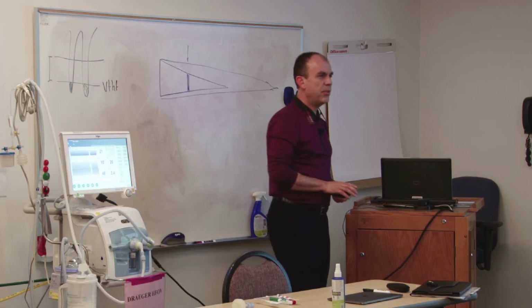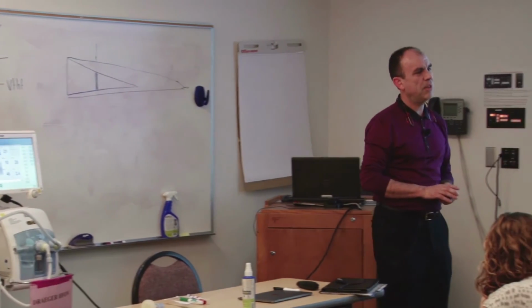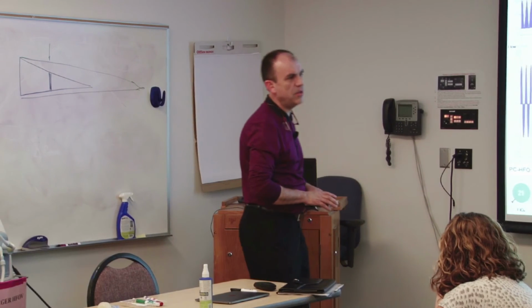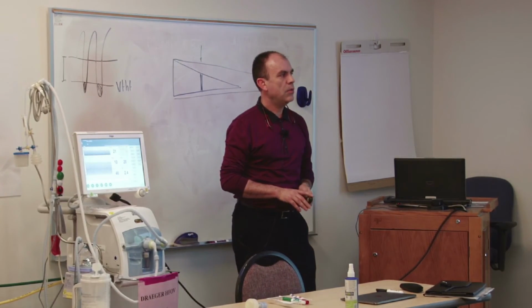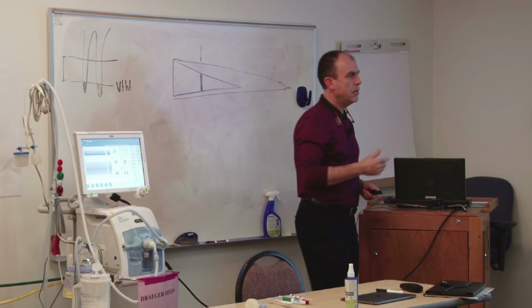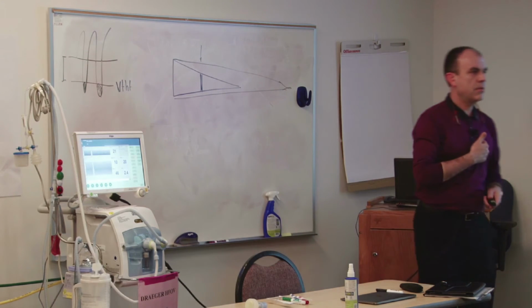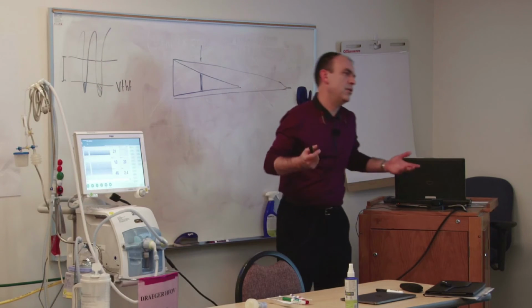Do you use transcutaneous monitoring? Yes, we've had some problems with some equipment lately, but we try to use that a lot. Generally a baby that's on high frequency is monitored with NIRS, transcutaneous CO2, and saturation, obviously.